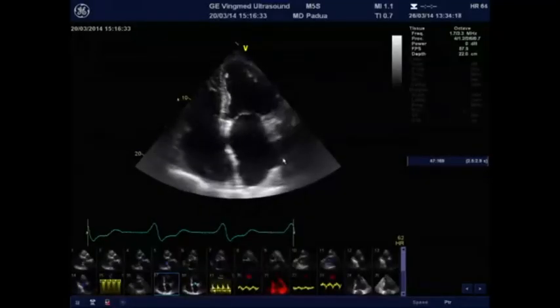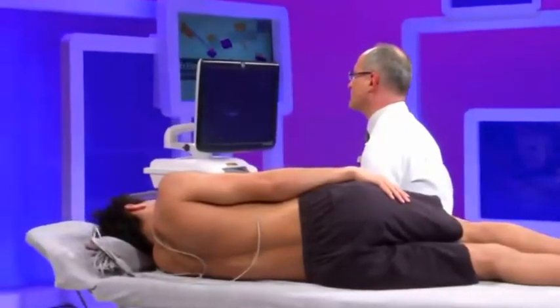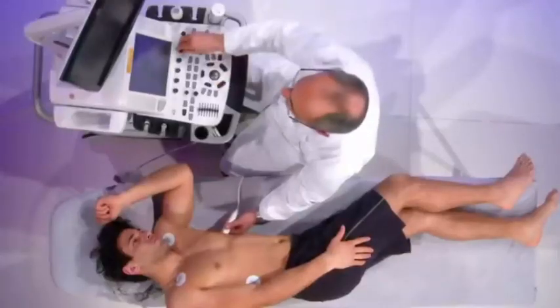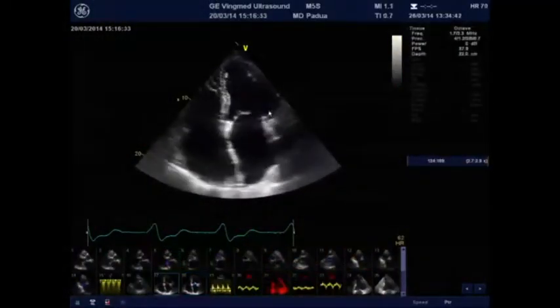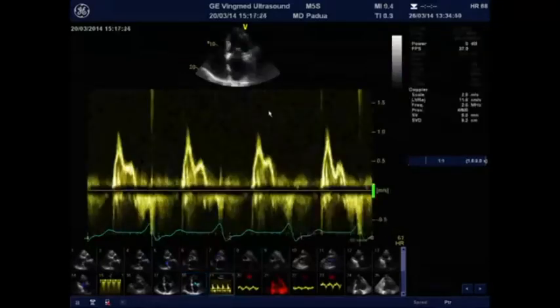This explains these huge atria that are typical of the heart transplant performed with this technique, and also the presence of these suture lines that show you the region where the native atria have been sutured to the acquired ones. And the four-chamber view also provides us an overview of the left ventricular function and the right ventricular function. Then you can turn on your color modality to check again the regurgitations.